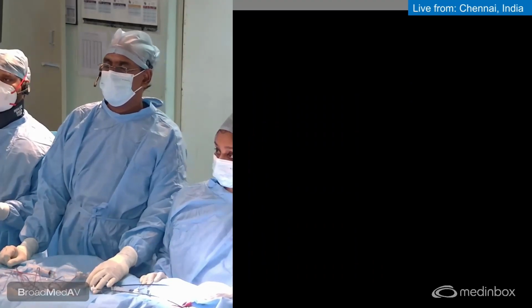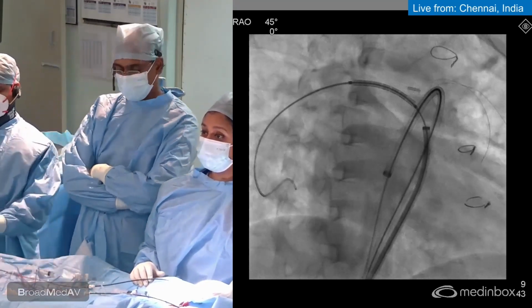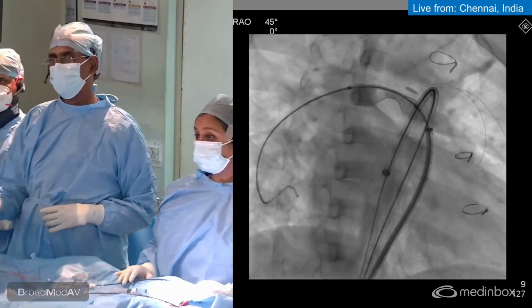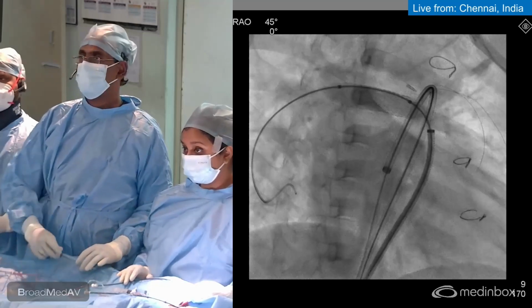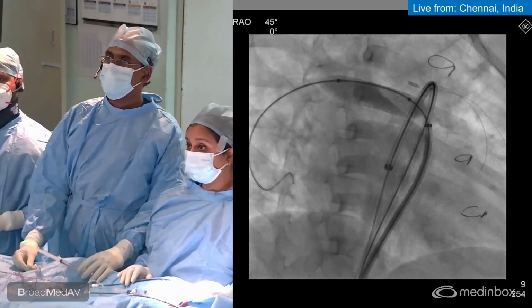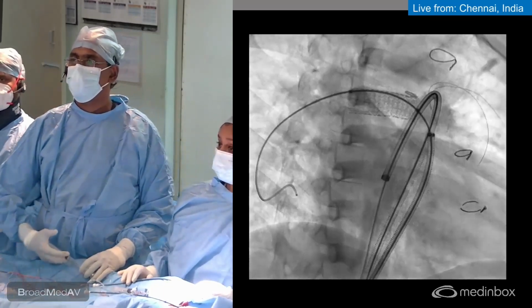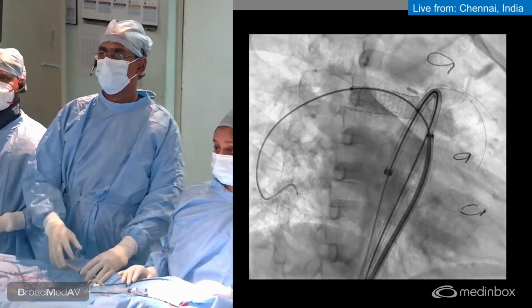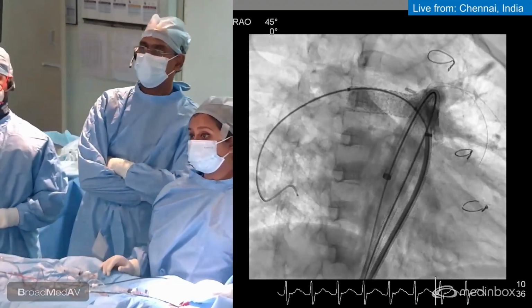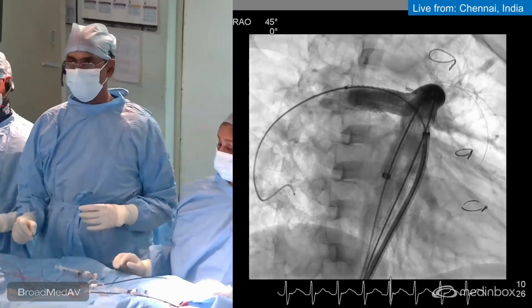Now we can deflate. Fluoro-store this and show us again. So this is the expansion sequence. Our proximal end of the stent is remaining proximal to that metallic marker throughout. So let us see the position now. Okay, we seem to have fixed. But if you look at it, the distal part of the stent needs to be flared a little bit more.